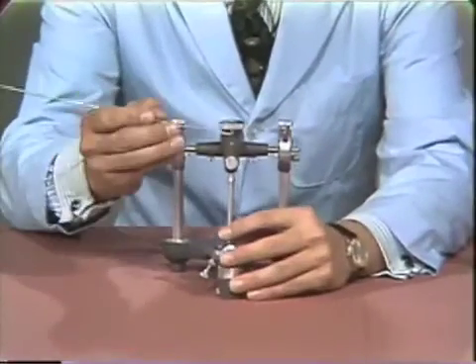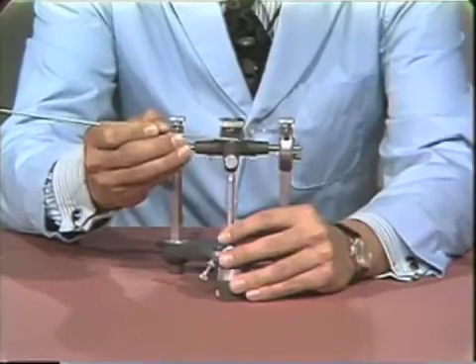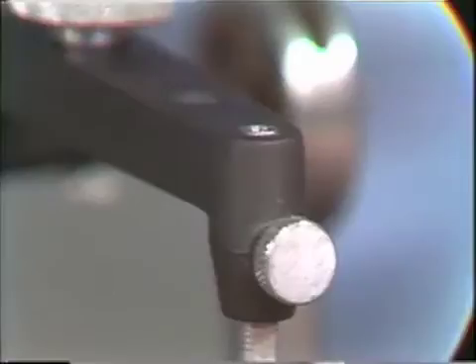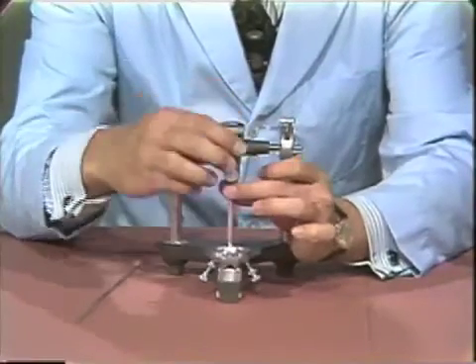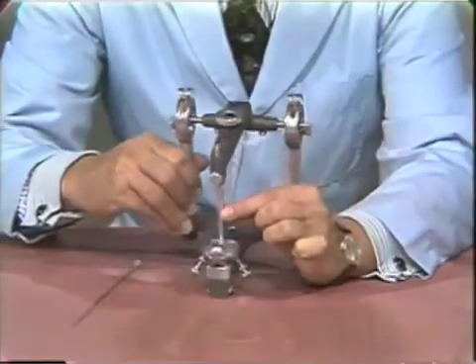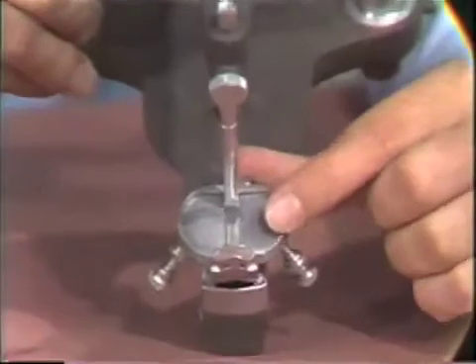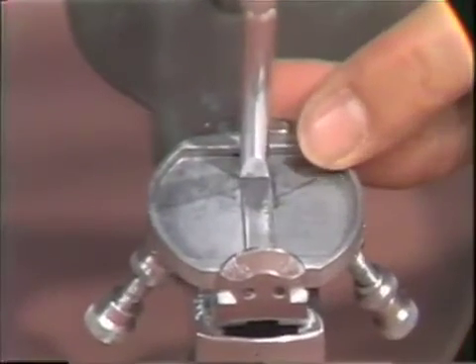The incisal pin must be flush with the top of the table in order for this alignment to be checked correctly. If I alter that relationship, you can see the pin indeed does change position on the table in the antero-posterior direction.